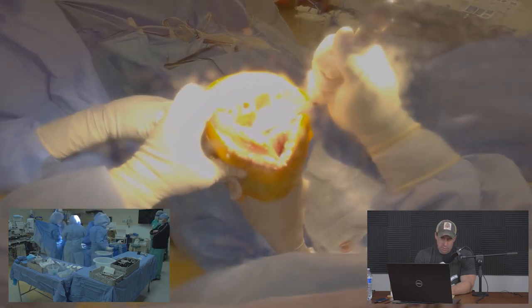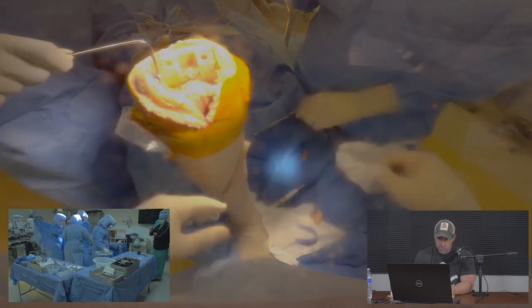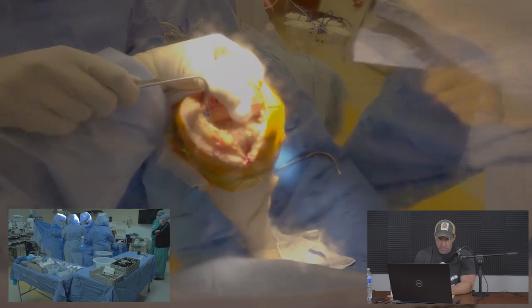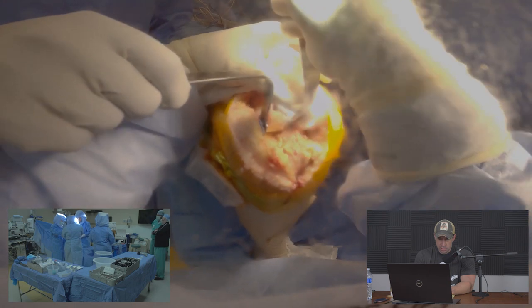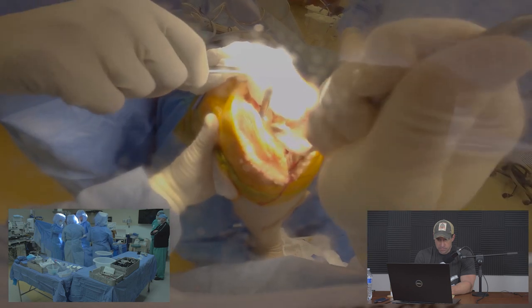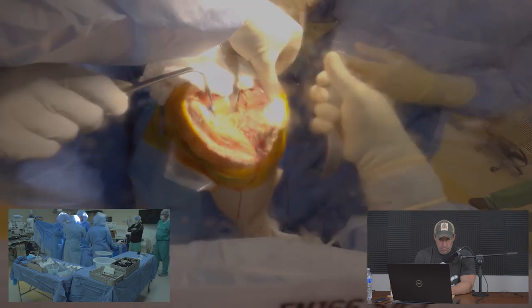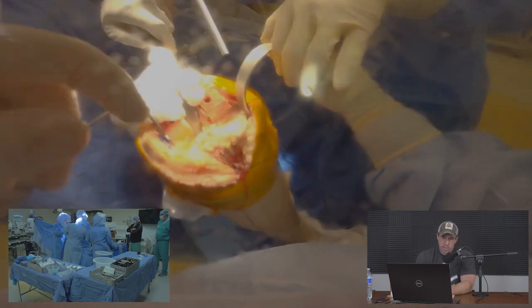We're repositioning retractors to proceed to the tibia. I use a laparotomy sponge to protect the bone so I'm not levering against it unnecessarily with the retractor. We bring the tibia forward and place a retractor on the medial side to protect the ligamentous structures and provide exposure.